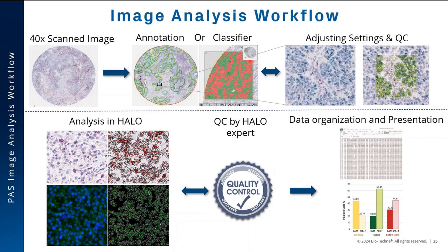A real-time tuning window is used to dial the algorithm to segment cell boundaries and to identify RNAscope dots based on user-defined inputs. The analysis is initiated and the data generated. The cells with white have no expression, pinkish have low expression, red have high expression.